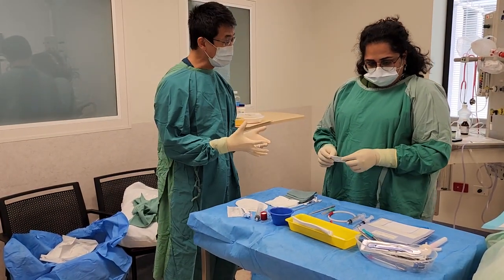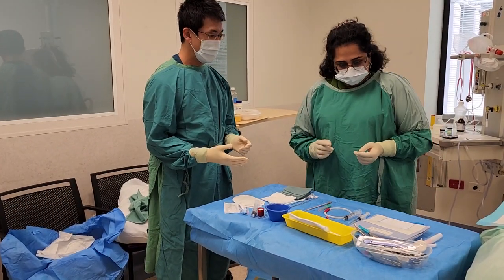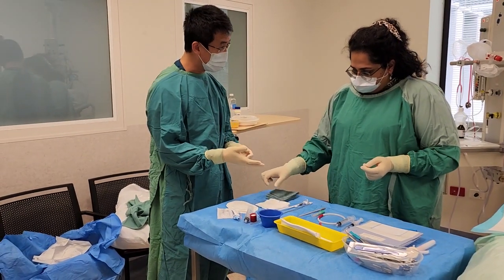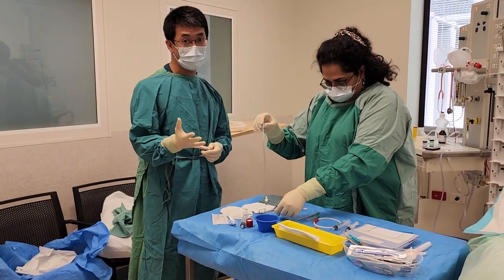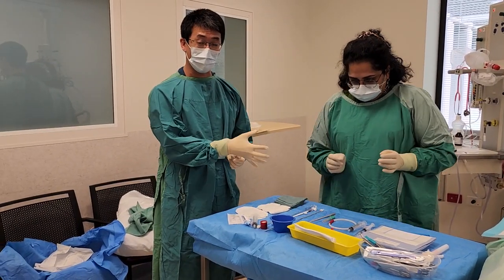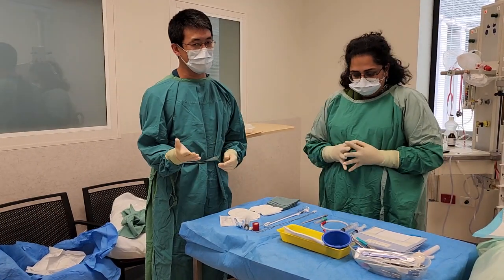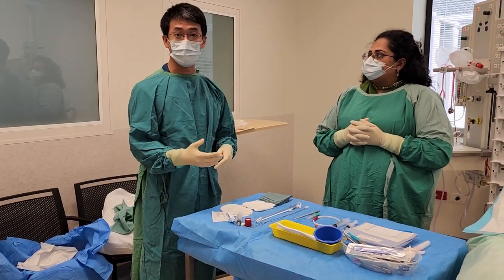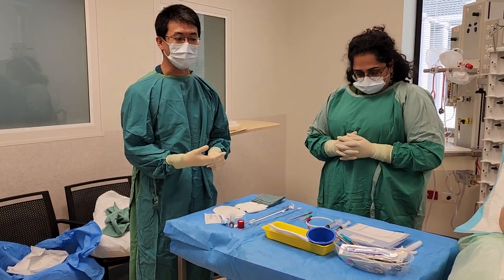So what we'll do is I'll get you to go through all the equipment that we have in front of us, the steps that you're going to perform to put this chest drain in, any complications that you might expect and how to troubleshoot. From then on, we're actually going to put the chest drain in together. She's going to be the primary operator and I'm going to be the assistant, and I'll troubleshoot along the way. Unfortunately, once again, because we don't have consent from the patient, we won't be able to film that. Afterwards, we'll have a debrief session where we'll give some feedback and see how things go.